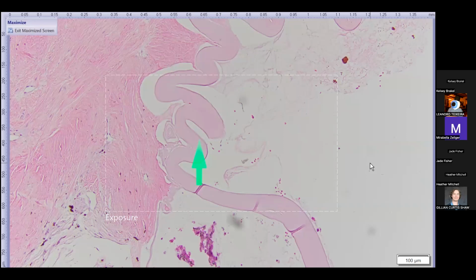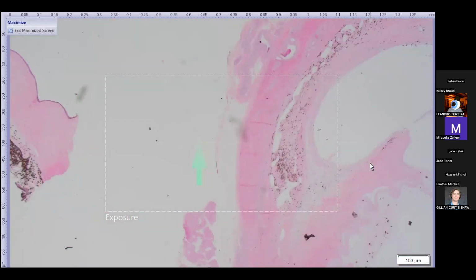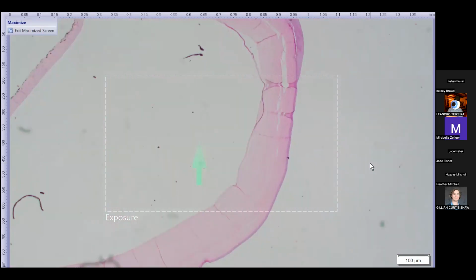So long story short, we told them what they already knew. This is a really good example of what blunt ocular trauma can do to the eye, especially give it a bit of time to heal and do its thing. Before we move on from this case, just some interesting features. I believe SF2 described some corneal changes, which were also part of the reason why this dog globe eventually got enucleated. And here we have the cornea.